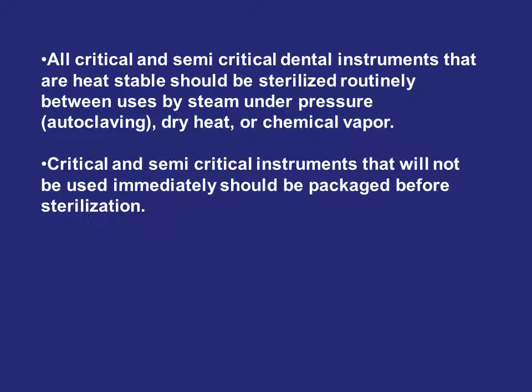All critical and semi-critical dental instruments that are heat stable should be sterilized by any type of sterilization method that is suitable for that instrument, such as by autoclave, dry heat, or chemiclave, while critical and semi-critical instruments that will not be used immediately can be packed before sterilization.